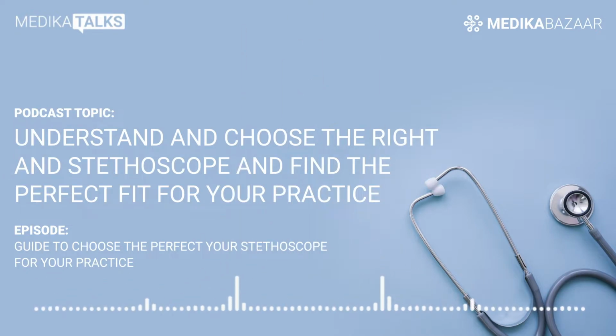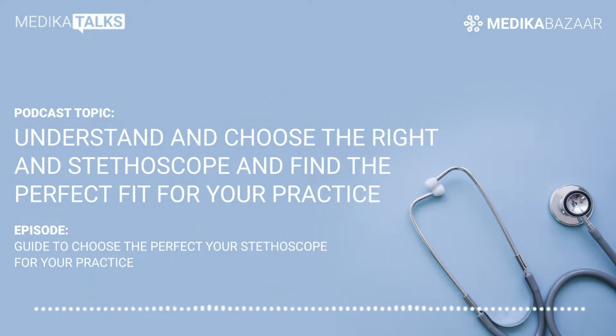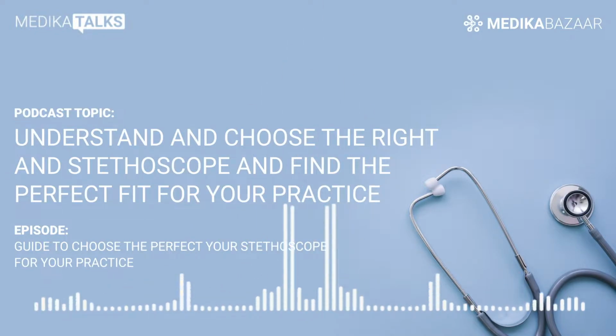The stethoscope may be one of the most common pieces of medical equipment, but that doesn't mean buying the right stethoscope is simple. The word is derived from the Greek words stethos, meaning chest, and skopion, meaning to view or see. The stethoscope is an acoustic medical device used for auscultation, or listening to the internal sounds of an animal or human body. It is typically equipped with a small disc-shaped resonator.